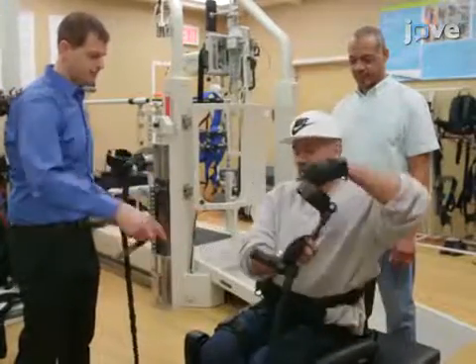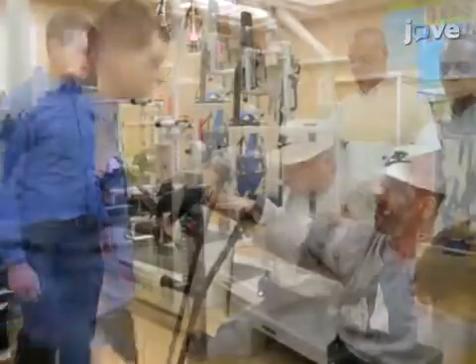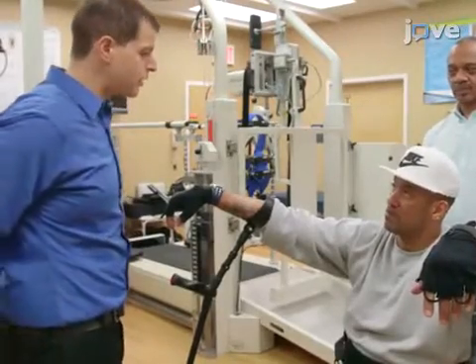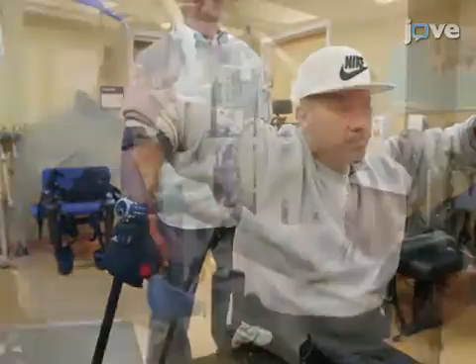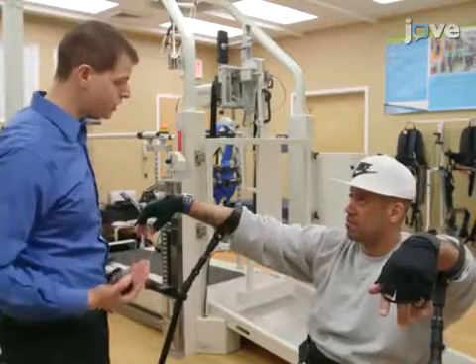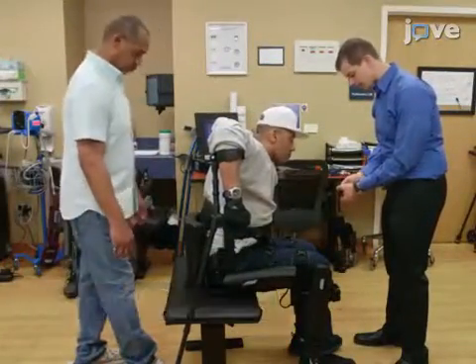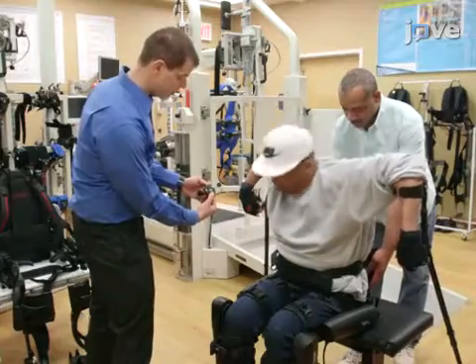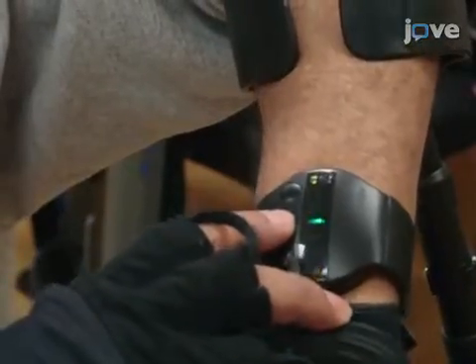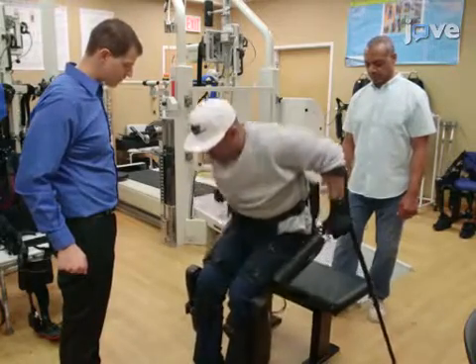Begin by equipping the participant with a set of forearm crutches to assist with balance and maneuverability of the device. While seated in the exoskeleton, instruct the participant to place the tips of the crutches posteriorly in a manner that gives them the ability to push their weight over their feet. Explain the sit-to-stand procedure to the participant, with one trainer assisting from behind and another guarding from the front. Instruct the participant to press the stand command, then place the crutches posteriorly and lean forward while pushing off the crutches to assist the device in standing them upright.